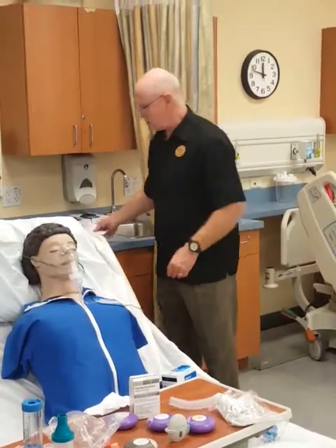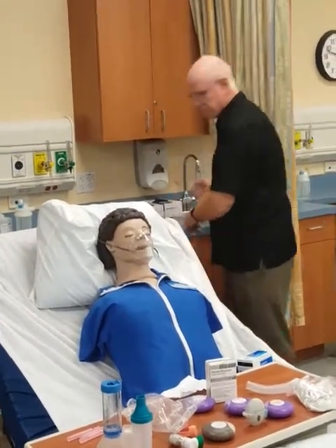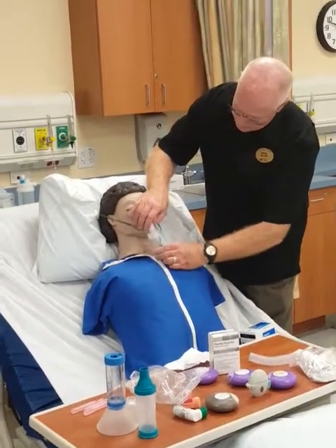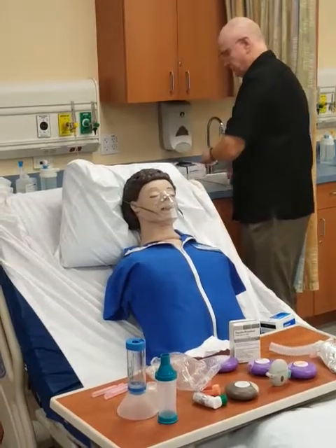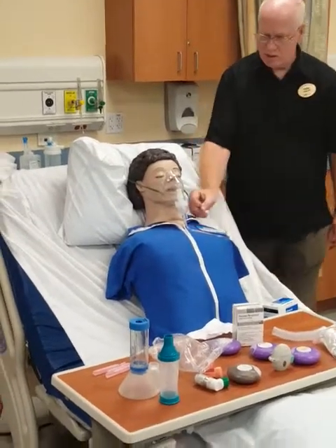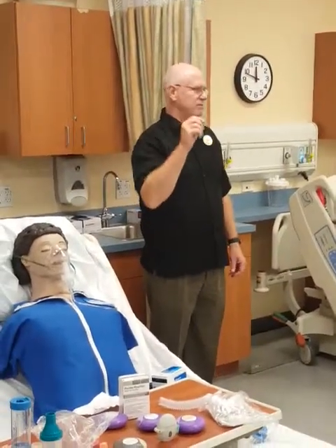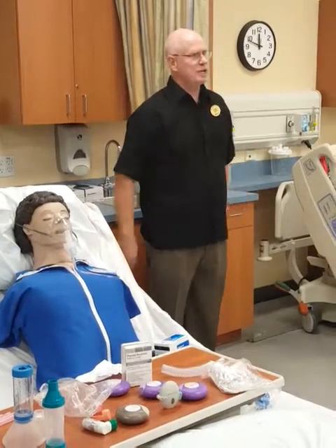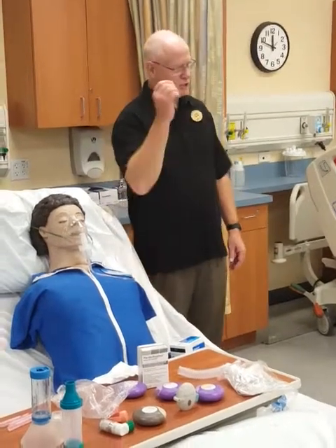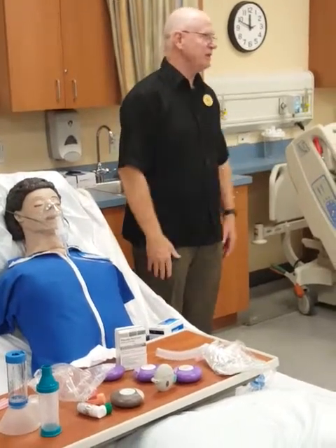Verbalize how the treatment is finished. When the treatment is finished, it's going to begin to sputter — you'll hear it. It's like popcorn: when it stops popping, it's done. It'll just start to sputter, then slow down, and then it'll be dry. Then it's finished.